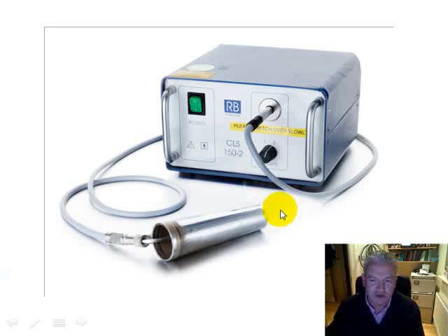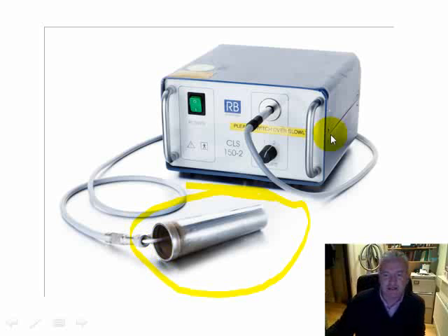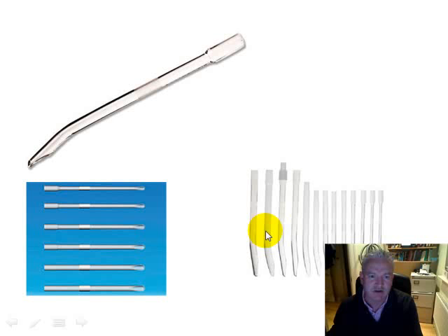Other things, potentially, that you could be shown is an amnioscope. An amnioscope is used during labor for taking small fetal blood samples from the top of the head. With this, I'm actually demonstrating or showing the light-generating source. So light is projected down through this with the end of the amnioscope up against the baby's head for taking fetal blood samples when trying to determine whether an abnormal CTG is associated with a low scalp pH. So that's just something else that you may be shown with respect to obstetric instruments.